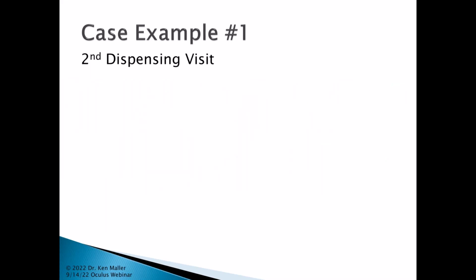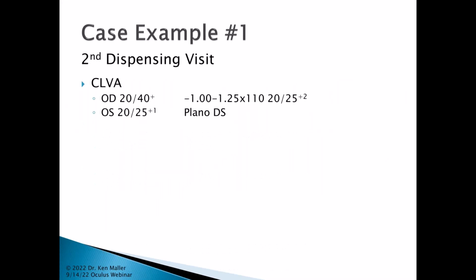So on the second dispensing visit, I did much better on the acuity, 20/40 plus, but I still had a bit of an over-refraction. And then the left one I hit dead on at plano.